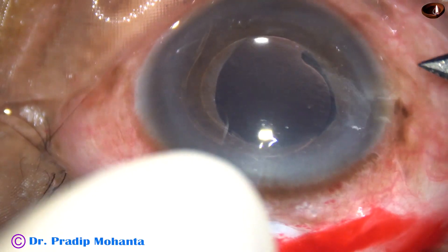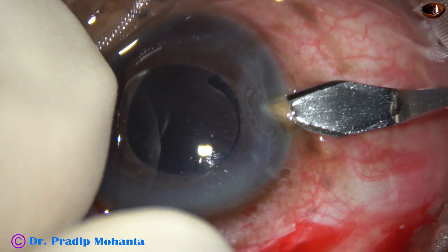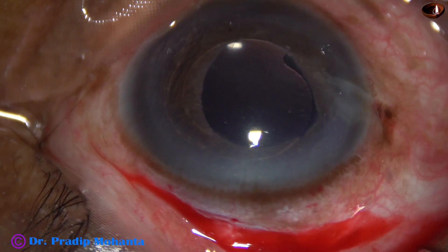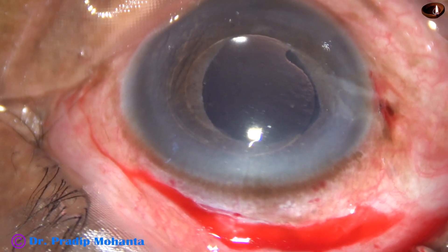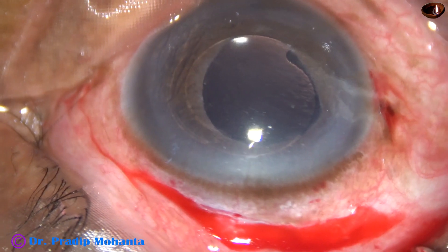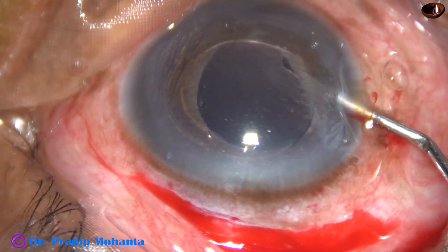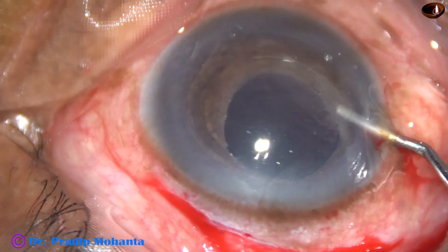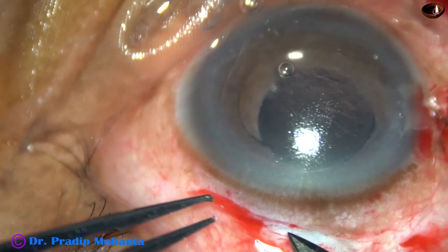And now I do a stab incision at the limbus at 9 o'clock. And now I inject 2% hydroxypropylmethylcellulose. The anterior chamber forms very nicely because the intraocular pressure is low now. I have removed some amount of vitreous.